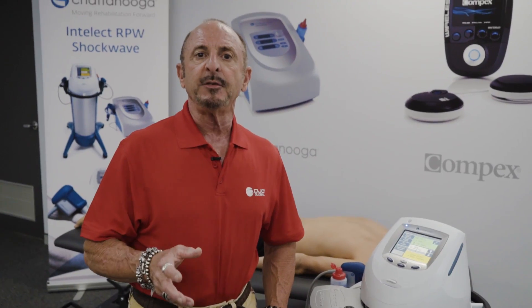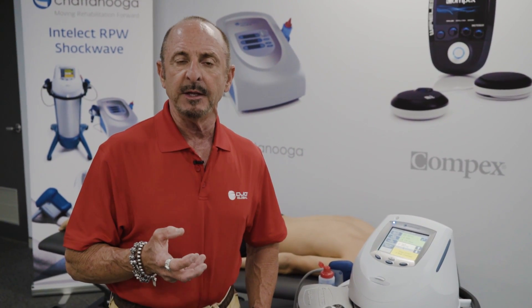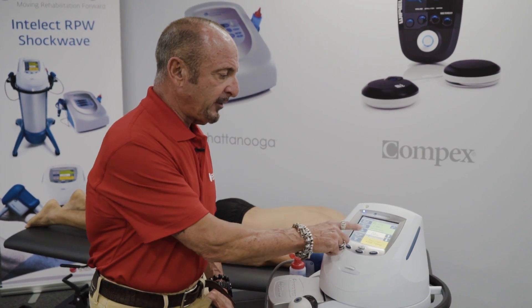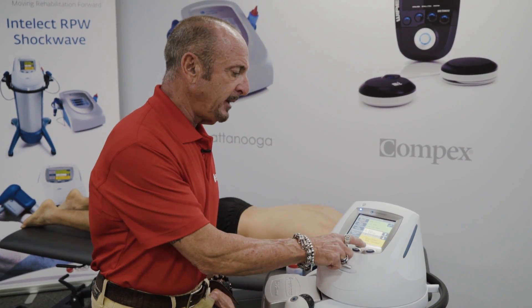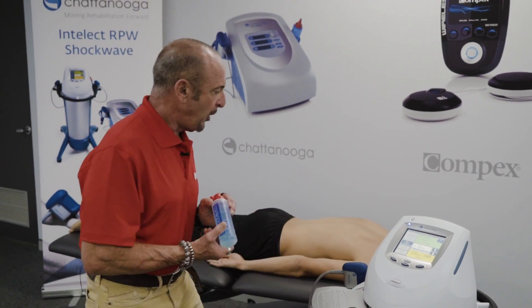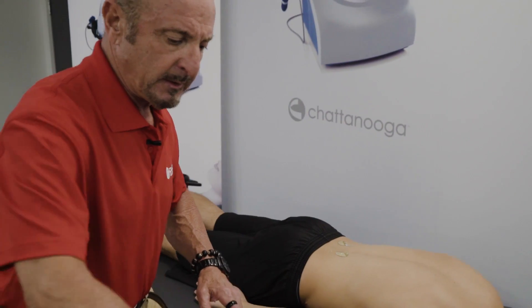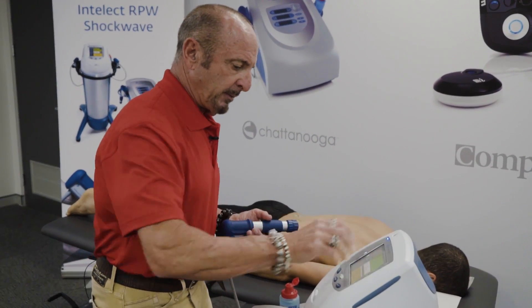After we finish the vibratory actor at one thousand to fifteen hundred, we're going to use our deep impact to really get in there and create the desired effect of decreasing muscle spasticity. We come back to our user screen, switch channels, confirm we're on the deep impact, go back to our low back pain protocol, and we're ready to begin. We apply gel over the primary area to lessen surface tension, confirm the correct transmitter is on, and we're ready to go.